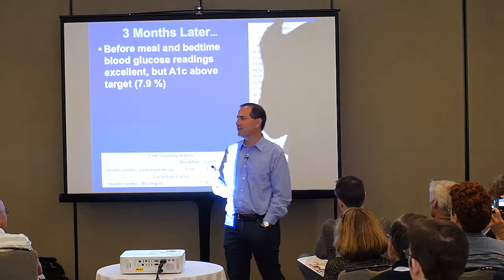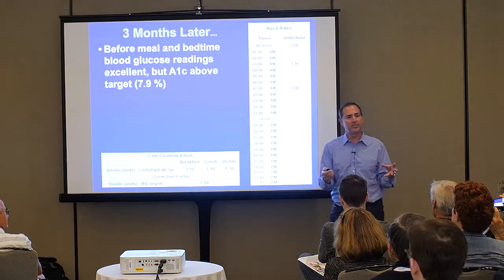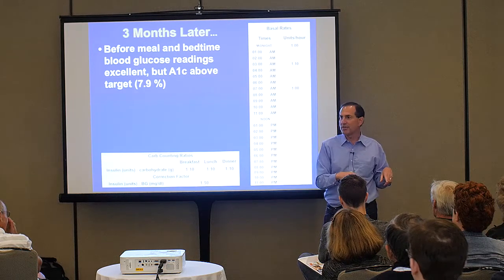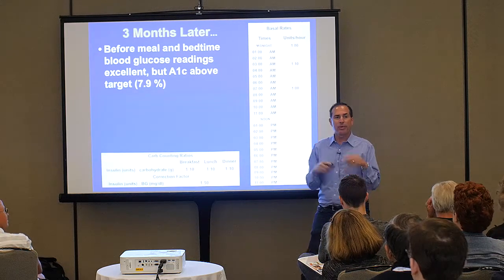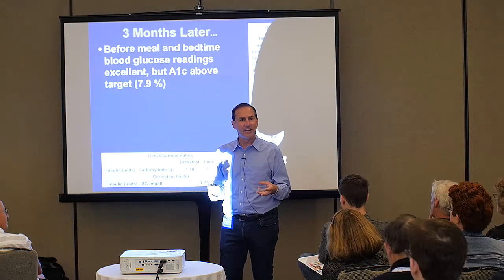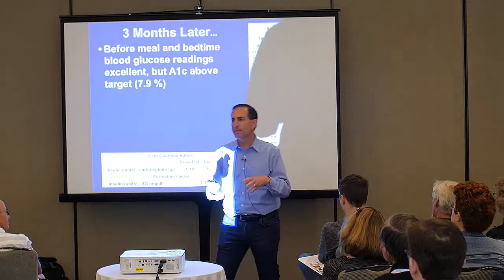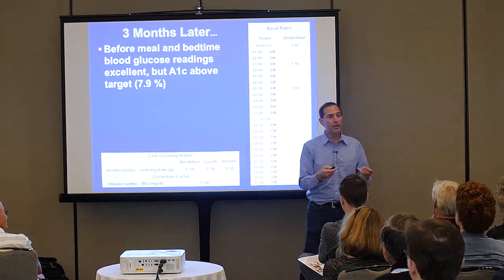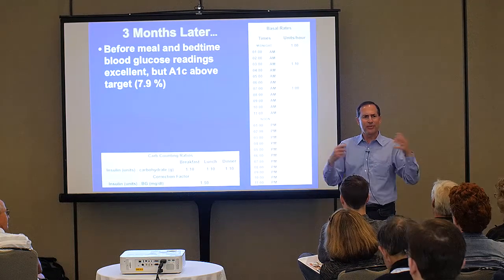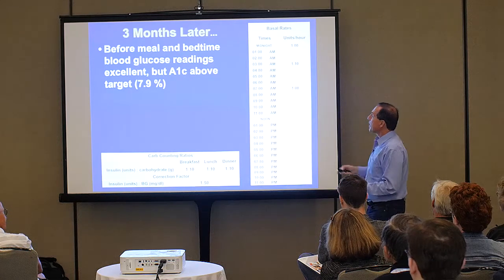Postprandial. What does postprandial mean? After meals. So most of you are using CGM, so you're aware of what's happening after meals. But before you were on CGM, you probably were not doing much post-meal testing. Because it's a pain. You're busy. And you were already doing 4 tests a day before meals and at bedtime, probably some extra. Very few people routinely check after meals because you're just busy with family and life and work and exercise and who the heck has time for that.